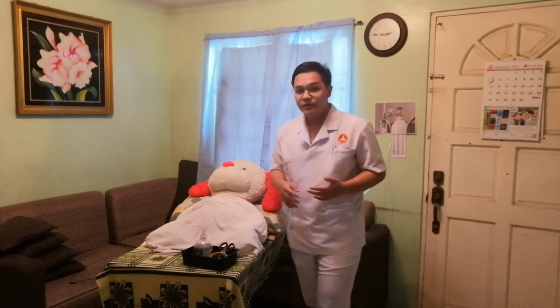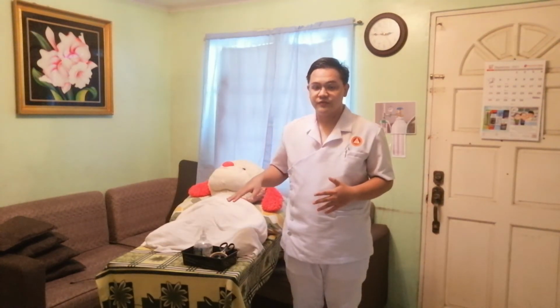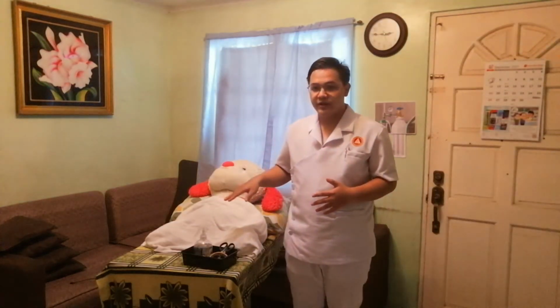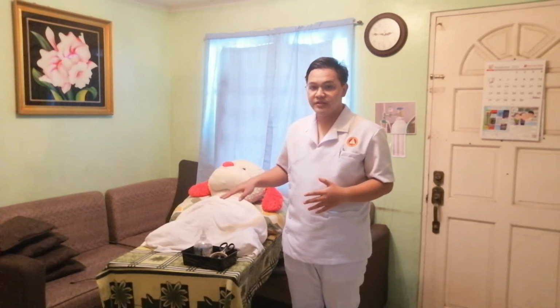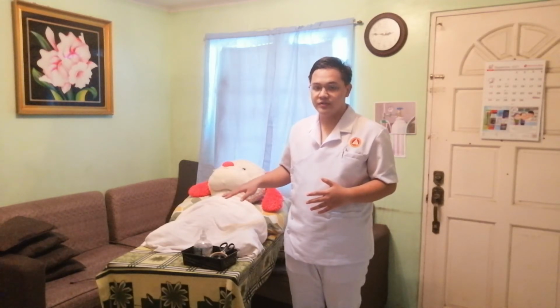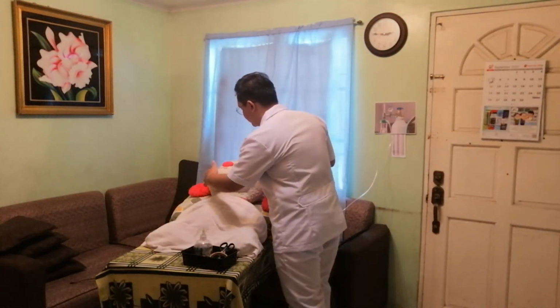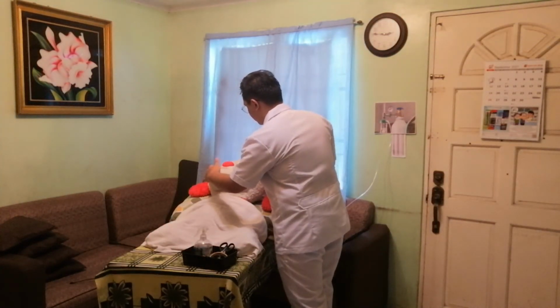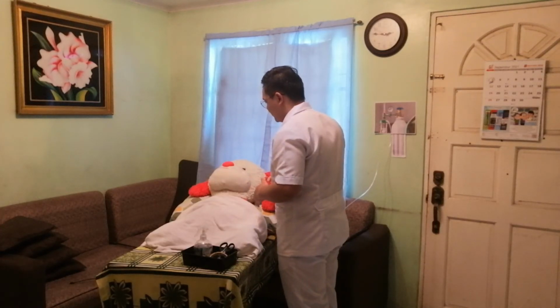Okay. Also, we will be checking the client's ears for any irritations from the tubing. And if there are present, we will need to pad the patient's ears, as it could help alleviate the discomforts coming from the tube. Okay, so how about sa ears po natin, ma'am? Are you experiencing any discomforts po? Like, masakit na po ba yung ating ears? Okay, so wala naman po.